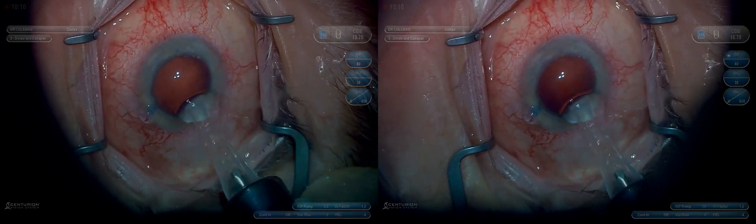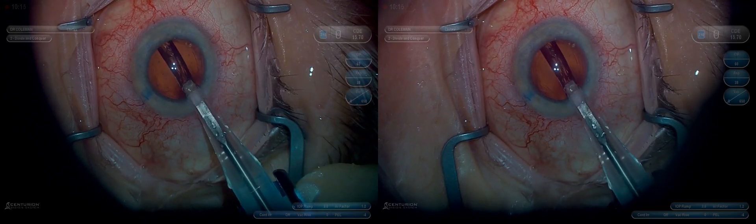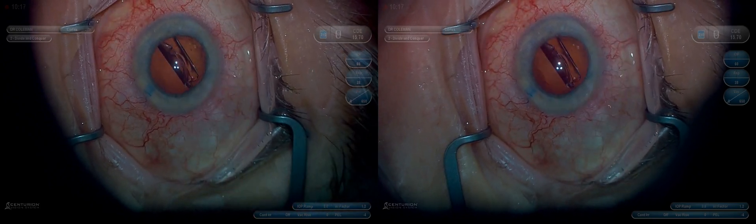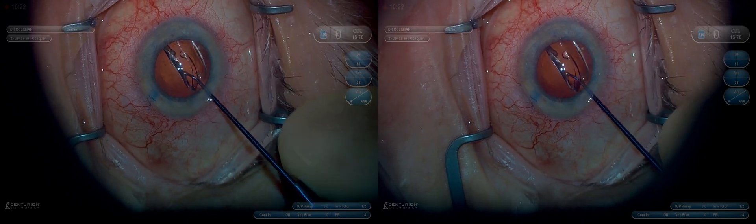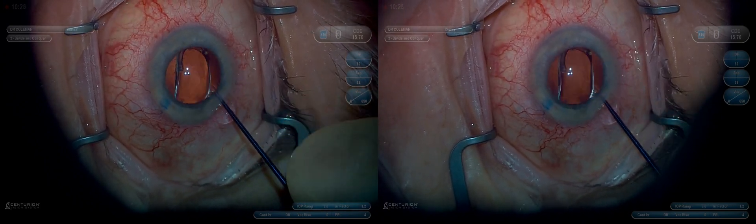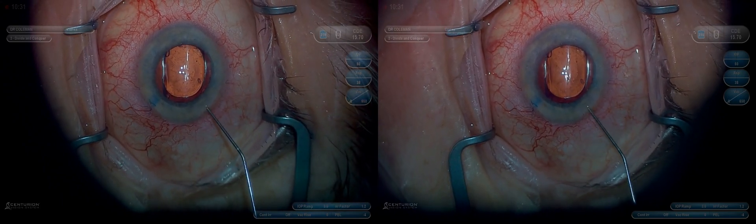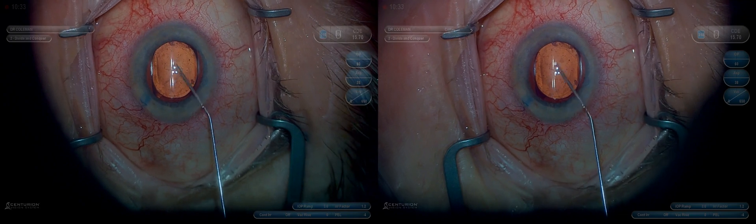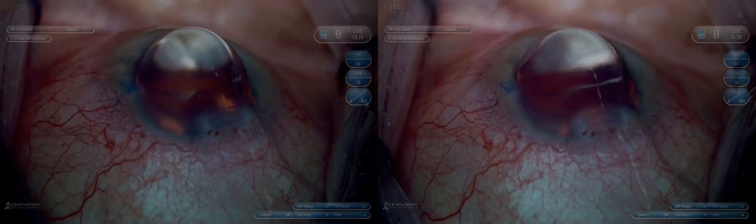Now that the lens is inserted, we'll place it in the bag and get ready for intraoperative gonioscopy. We'll fill the anterior chamber with some more ProVisc to try to open up the space at the anterior chamber angle. Get good visualization with the gonio prism. I love the Ingenuity particularly for these cases because visualization of the anterior chamber angle is basically unparalleled — I've never gotten a better view.